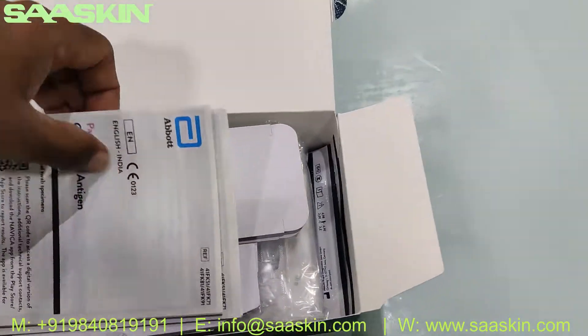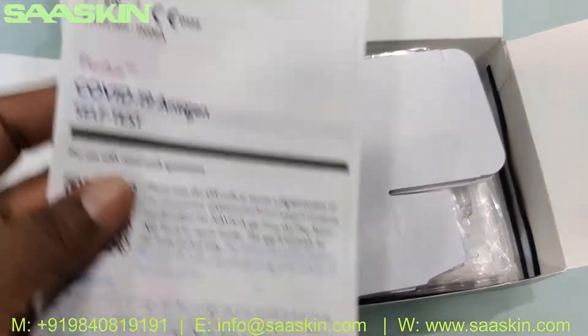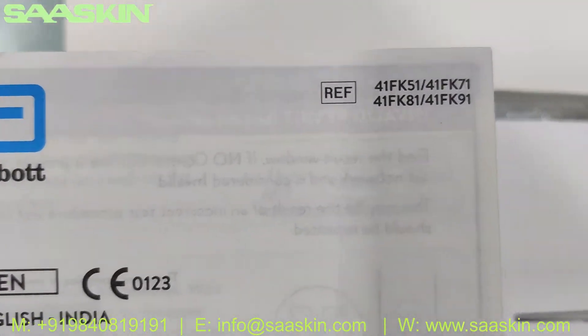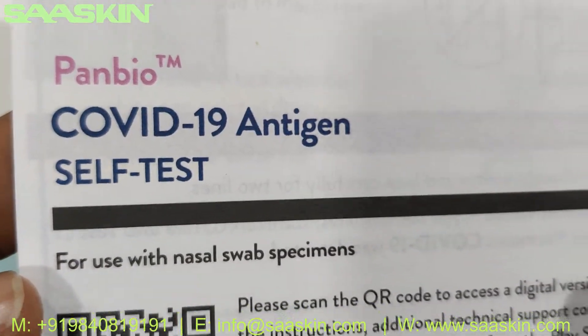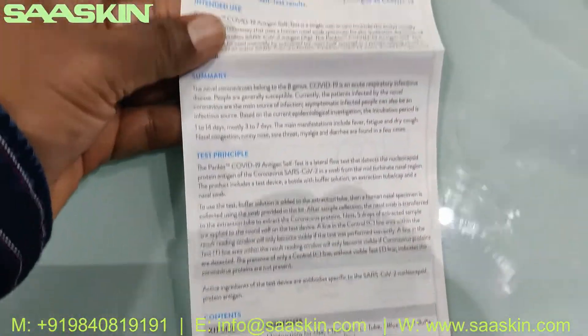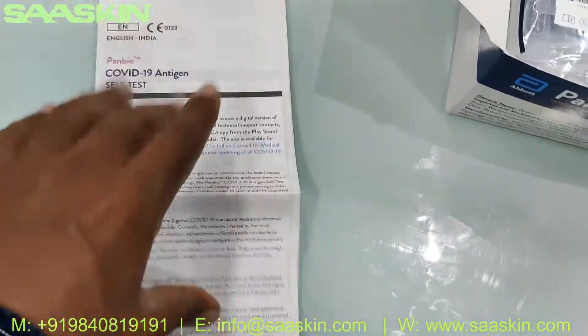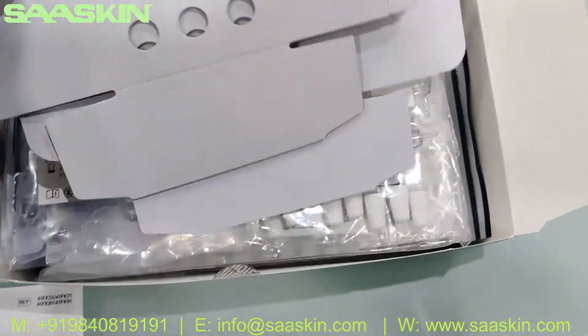I'll keep the other manual outside and just show you this one. There is an IFU brochure inside — Panbio COVID-19 Antigen Self-Test. This is the IFU brochure of the product with complete instructions for the test.